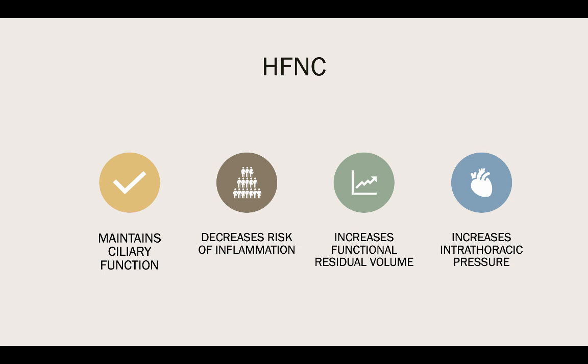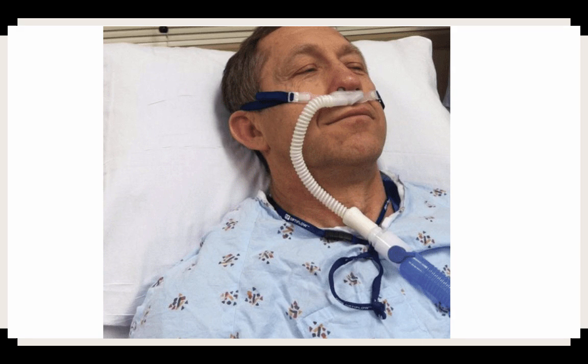So should you be doing high flow nasal cannula on your own in the back of the truck? That's a solid no. Just don't stick them on nasal cannula and crank your oxygen. It does need a special device. Does need to be heated. Does need to be humidified. So just a little extra info there for you.